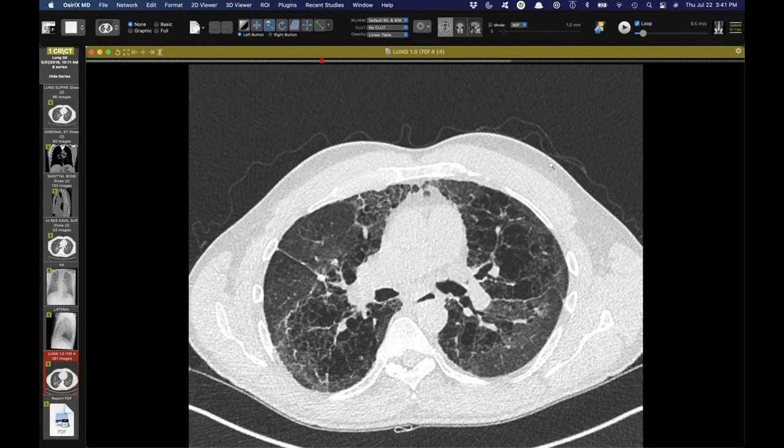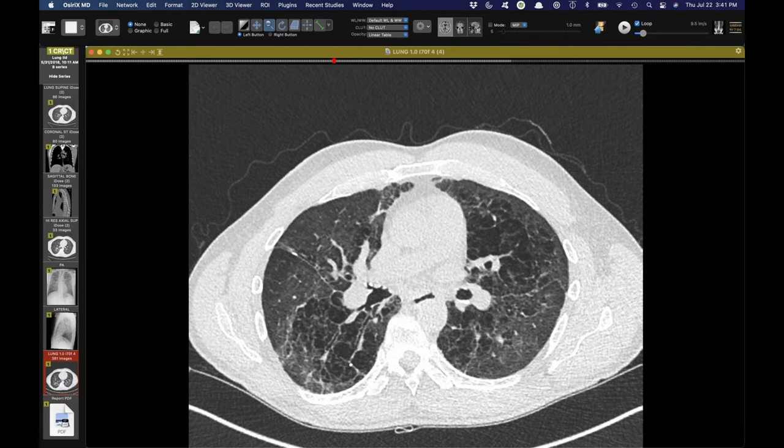So Travis, just because he's from Asheville doesn't mean he's always been there. I just wonder if he was exposed to any iron mining or welding or iron foundry fumes and stuff like that. This is really the distribution of something inhaled. Exactly. And that's why I was going to ask, with that mention of silica, has anyone ever seen silica or other inhalational disease without the conglomerate fibrosis, with just a bunch of emphysema like this?